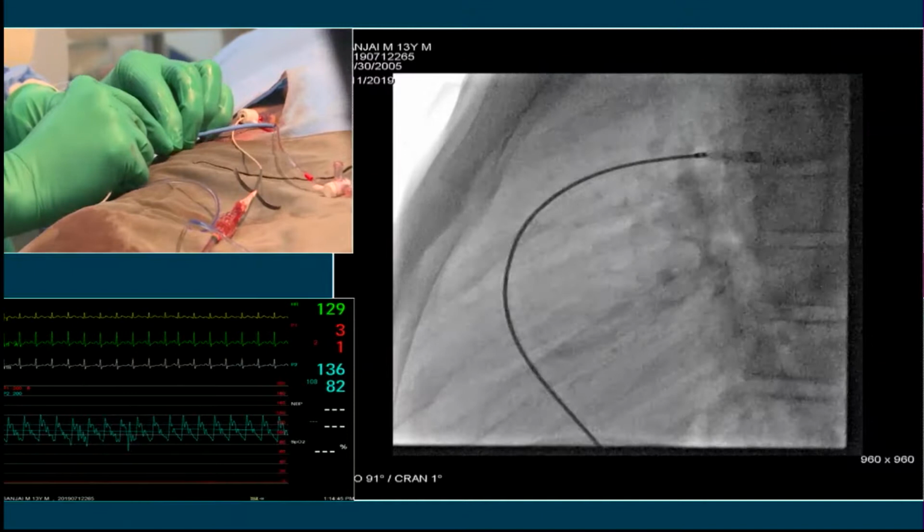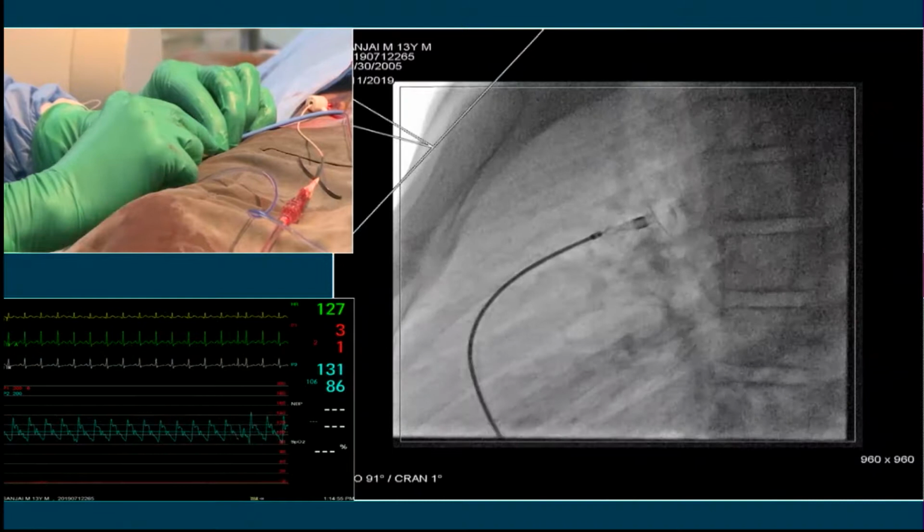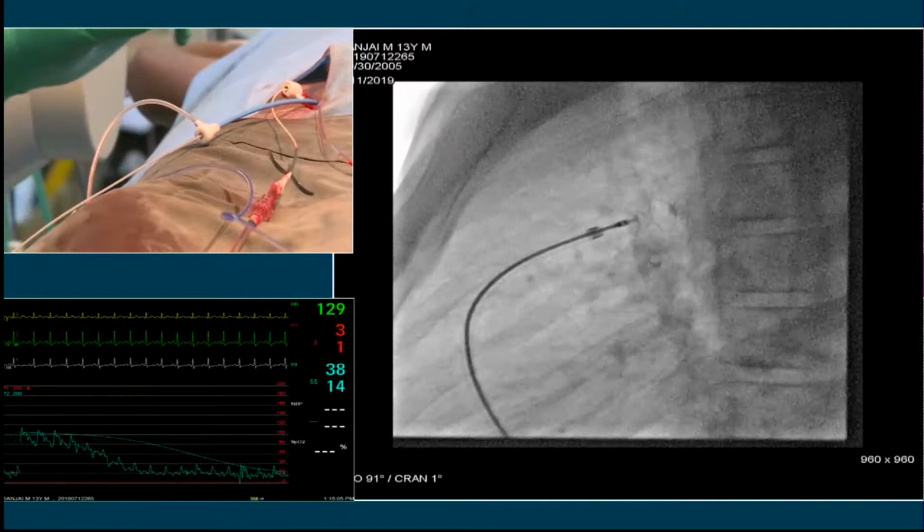What size coil will you go for? Since it's measuring around 3.5, a 6.5 into 5 coil would be good enough. Or even a 5x5 coil. Okay, thank you. I beg to differ because of pressures. It will require at least 2 coils. The cost of a device plus 2 coils is not much different from a device.